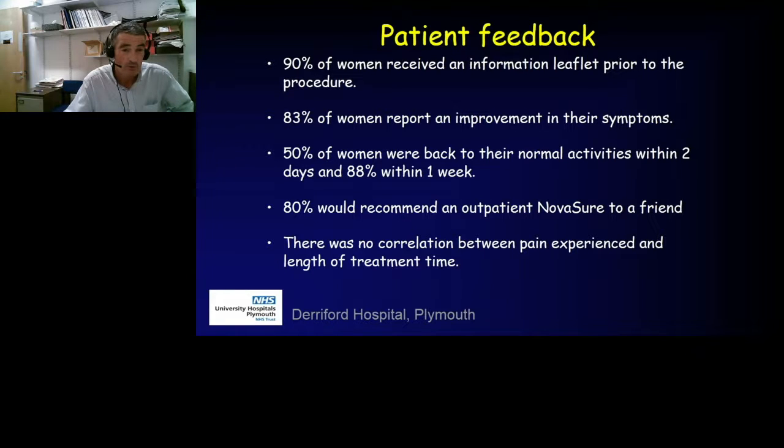So you can reassure, some of our patients returned to work after the procedure, but most took a day or 2 off just to recover. And 88%, almost 90%, had all gone back within a week. So that's all very reassuring for patients, giving them that sort of information to know what to expect.